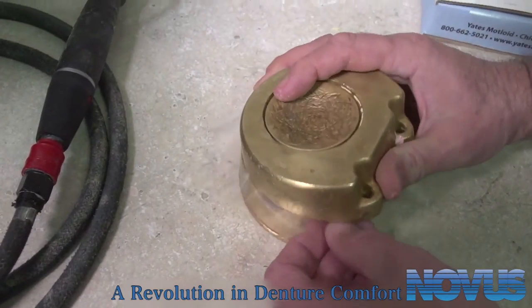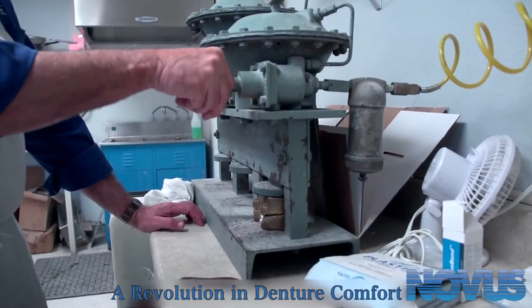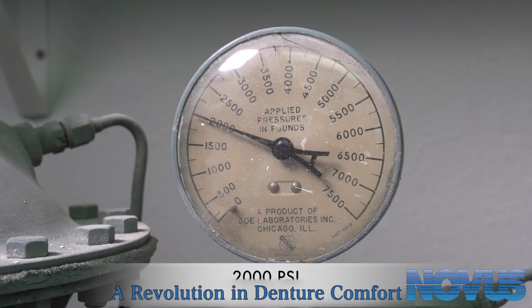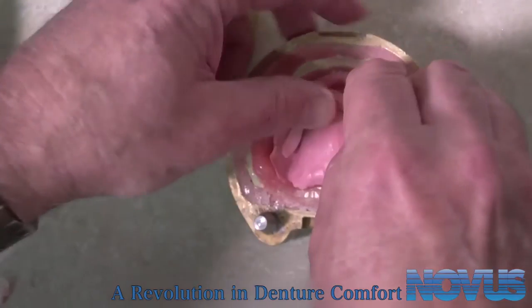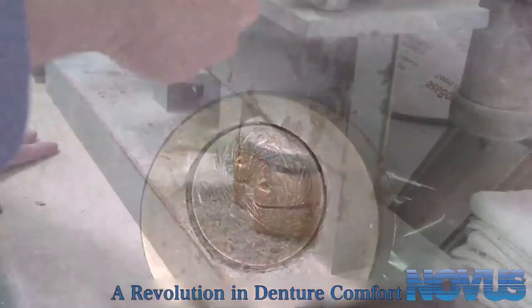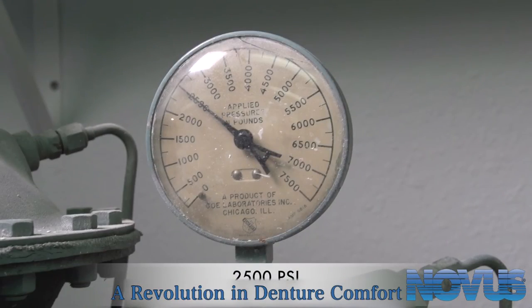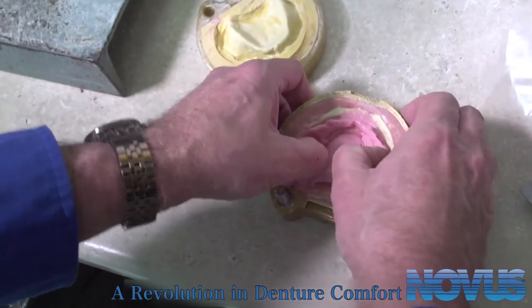Next, place two separating polyethylene sheets between the Novus and the cast and then run the first trial pack at 2,000 PSI for five minutes. Open the flask and thumb trim the Novus. Inspect Novus for under-packed areas and add more Novus where needed. Place one polyethylene sheet between the Novus and the cast and run the second trial pack at 2,500 PSI for three minutes. Once again open the flask and thumb trim the Novus.